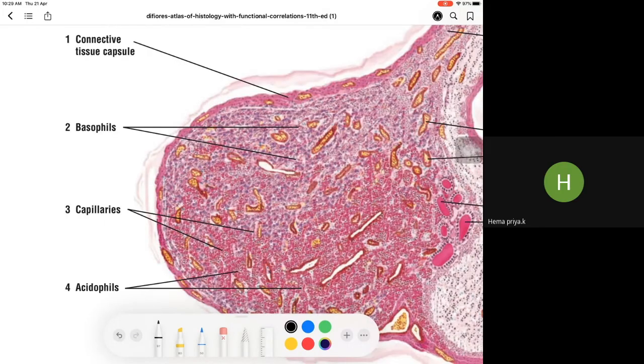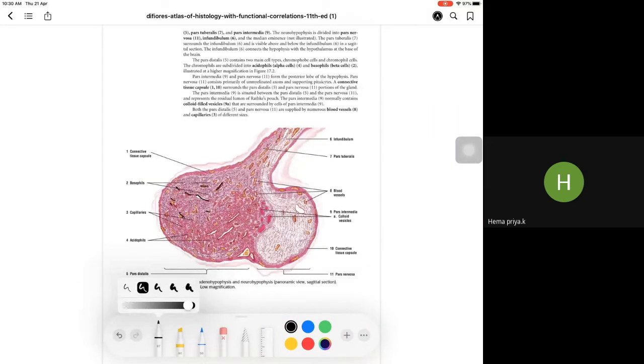Can you all identify a lot of blood vessels? Whatever the organ may be, neuroendocrine cells will have a distinct cell border, and usually they are seen as clusters, and these clusters are surrounded by vascular structures. Usually the nuclei will be in the periphery, and some of them will have a plasmacytoid appearance.